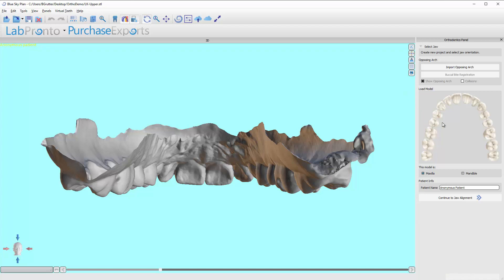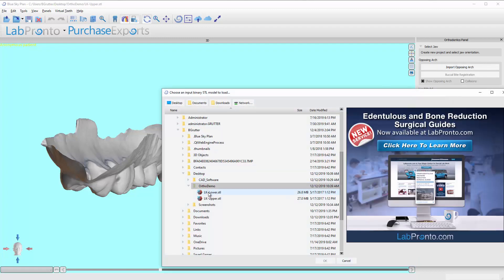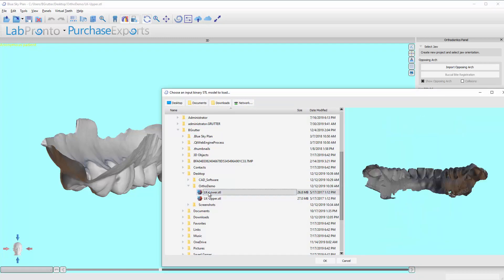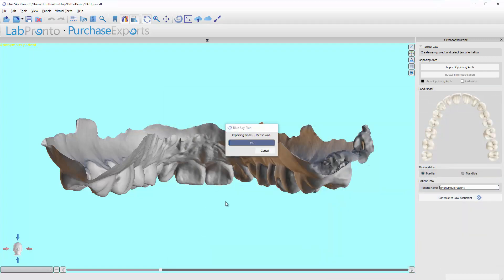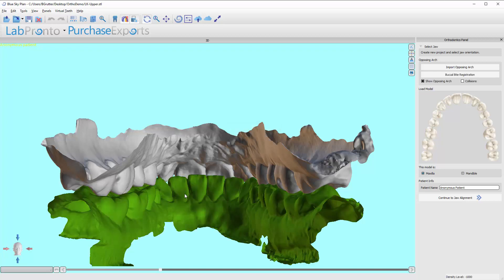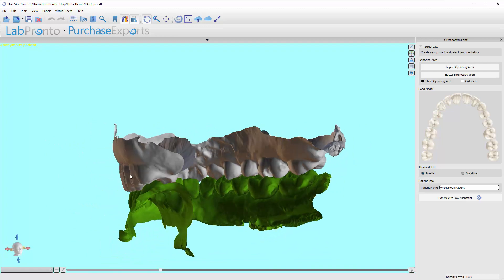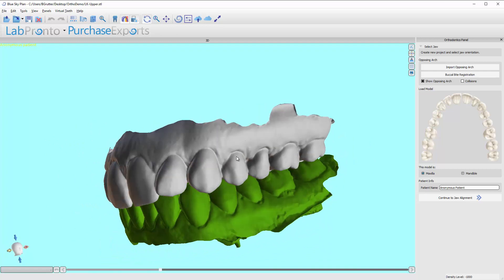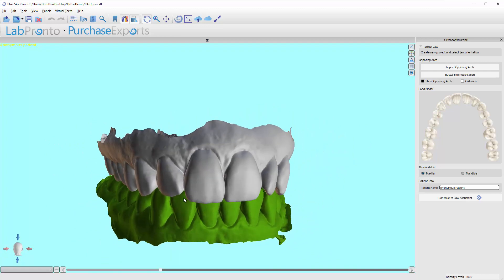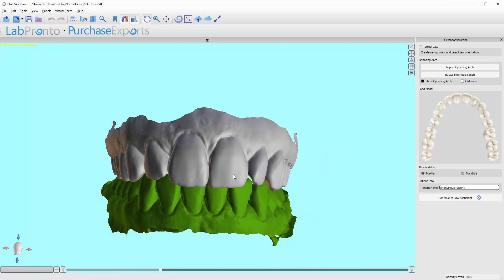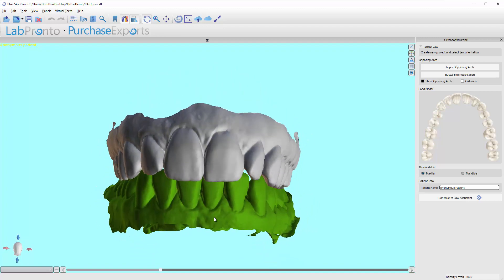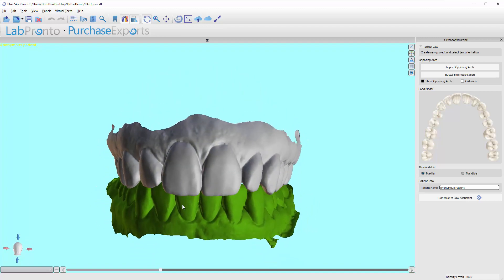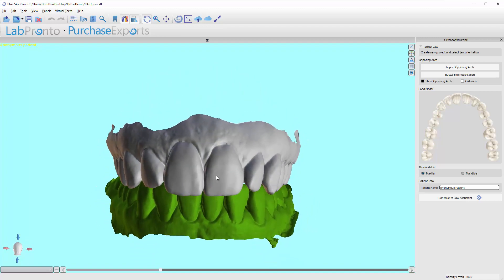So now I'm going to work through this panel. I'm going to click on import opposing arch. Now I'm going to find the lower model. Here it is. Click okay. And now it will import that. Depending on the file size, it can take longer or shorter. These files are actually fairly large. The models I use now are much smaller, so they load faster. Not a big deal. But just so you know, depending on the file size, your outputting will be quicker or slower in the loading.